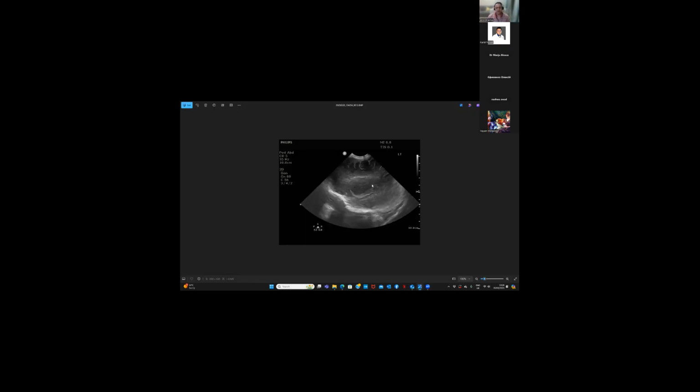So did you do the scan on your own, or did you have a nurse help you? Nurse was holding. Yeah, it was two people doing the scan. And was the baby in a cot? She was on a platform under the warmer, on a warmer. Okay. Fair. That's good. With some sucrose and pacifier. That's good. Well done.